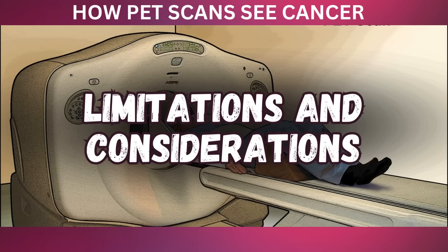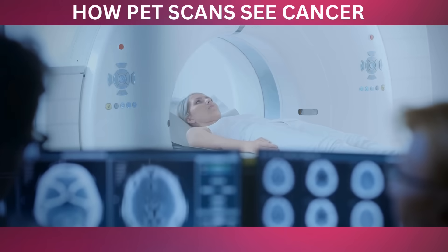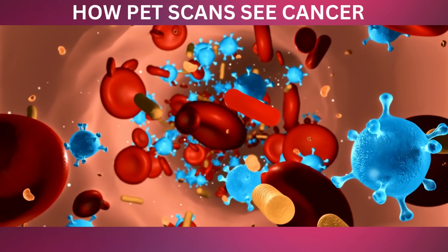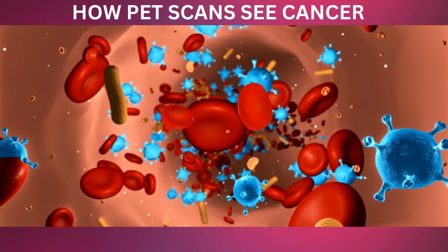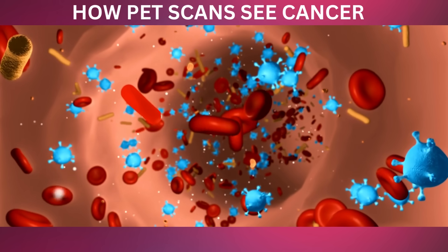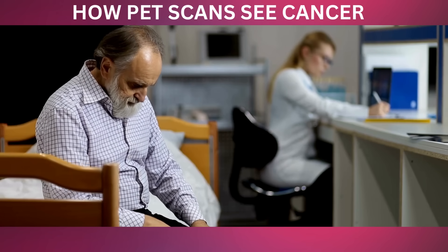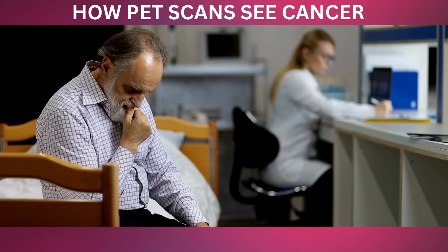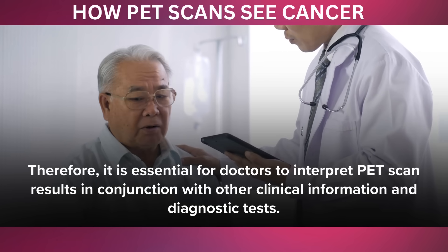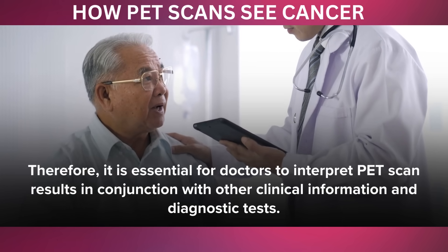While PET scans are incredibly useful, they have some limitations. One of the primary concerns is the potential for false positives. Infections and inflammatory conditions can also show high metabolic activity, which may be mistaken for cancerous growths. This can lead to unnecessary anxiety and additional testing to confirm the diagnosis. Therefore, it is essential for doctors to interpret PET scan results in conjunction with other clinical information and diagnostic tests.